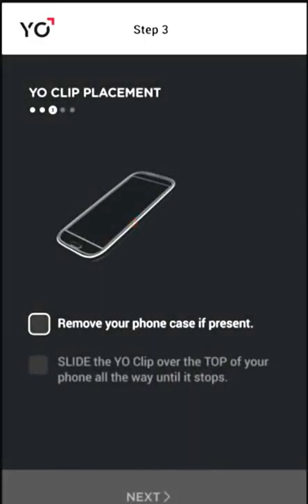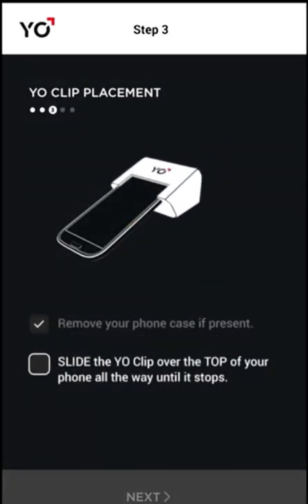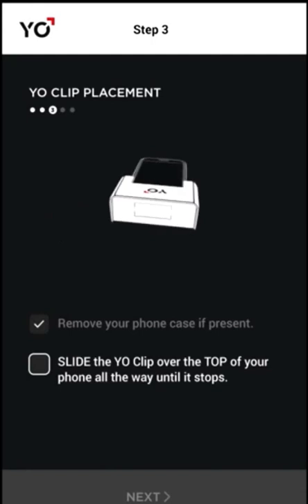Now it's time to prepare your phone for testing. Remove your phone case and slide the YO clip over the top of your phone as shown.